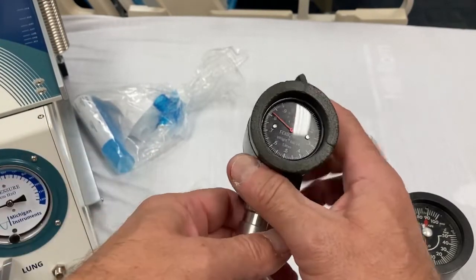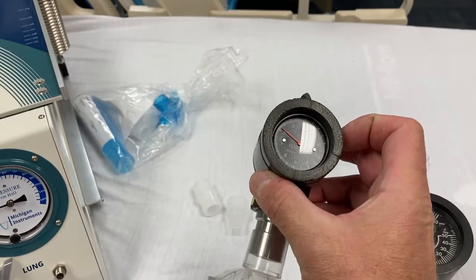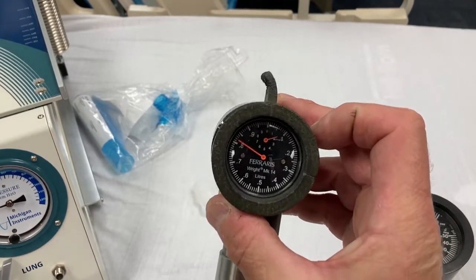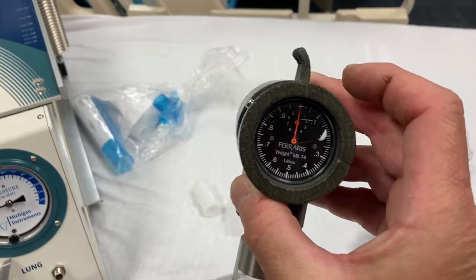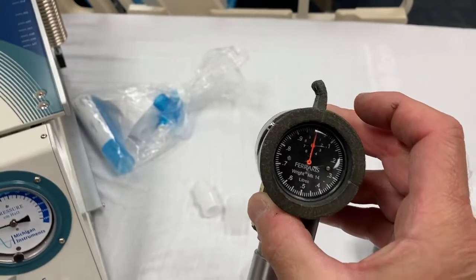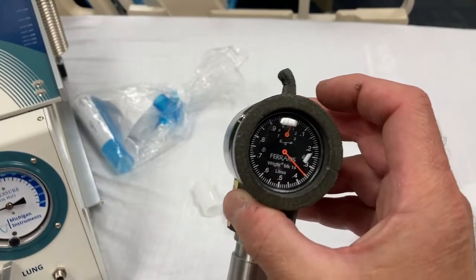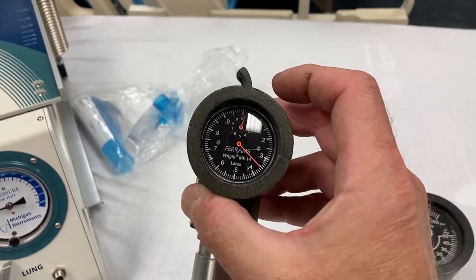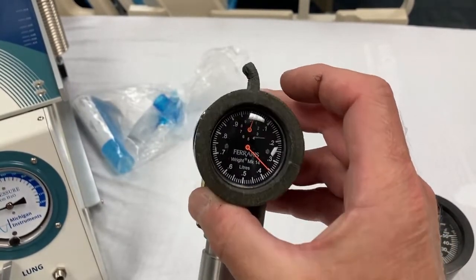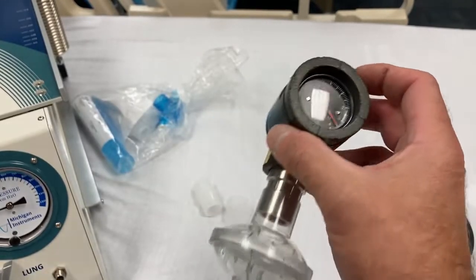All right, so we hook them up, we say, okay, breathe in as deep as you possibly can, and they breathe in real deep. And as soon as I think they're all the way in, I hit the button to reset, and then we have them exhale, exhale, exhale, exhale. Now I have a little test lung here, so I'm not pulling it up very far, but that's how you would do that. And you would just read your vital capacity.